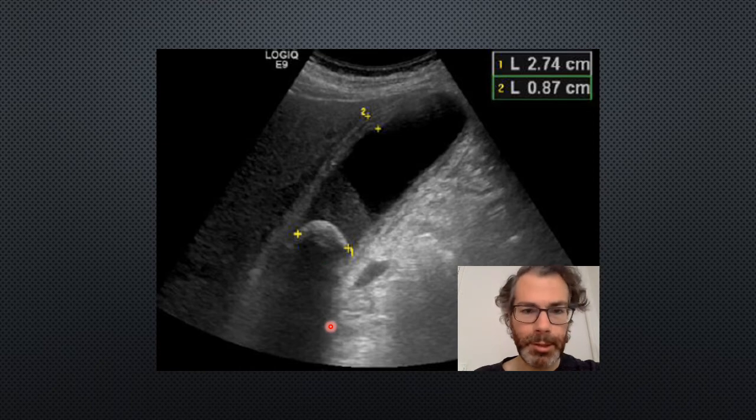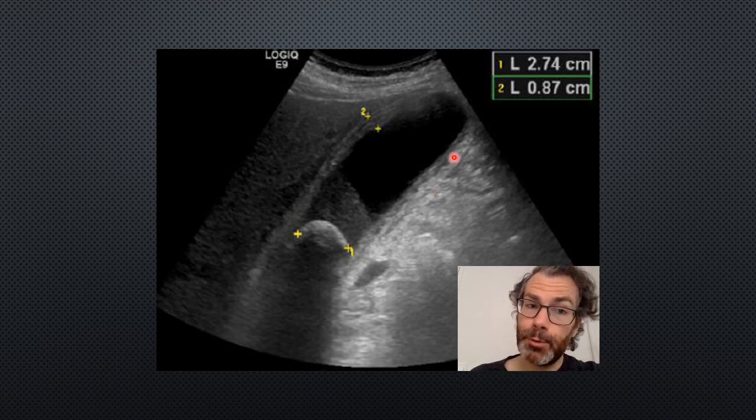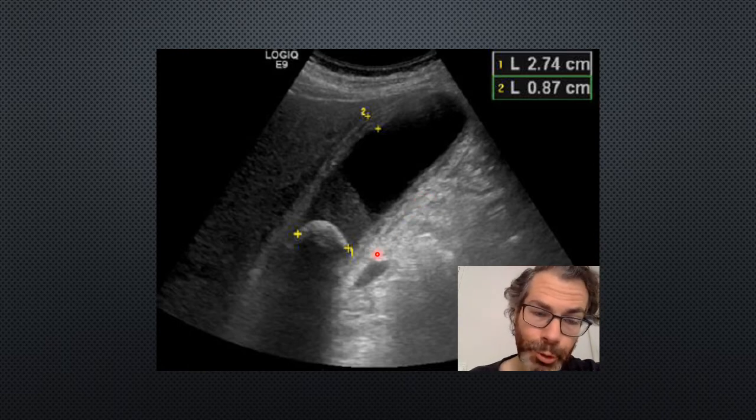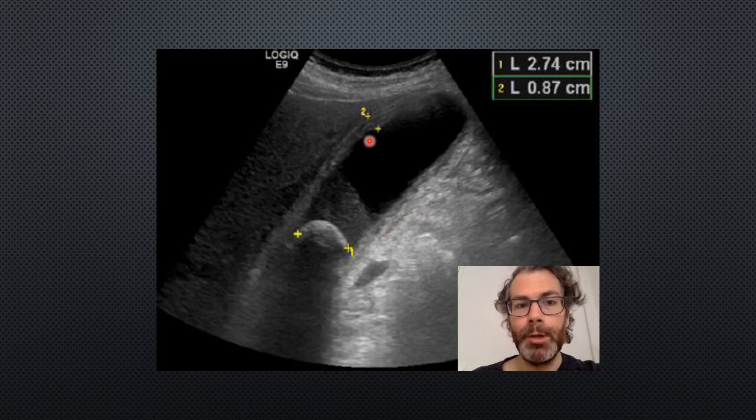It's been completely attenuated. However, when the ultrasound goes through a cystic structure, like the gallbladder or the urinary bladder, very little of that beam is attenuated. Most of the power of the beam remains in it. That's why behind the gallbladder, it's much brighter, because there's a lot more of that ultrasound beam strength still there. And this means it's difficult to actually see where the posterior border of the gallbladder wall ends, because you've got this bright post-cystic enhancement beyond the gallbladder anyway. I'm sure you can agree, it's really difficult to see where that posterior wall ends, and it's much more accurate to measure the gallbladder wall anteriorly.